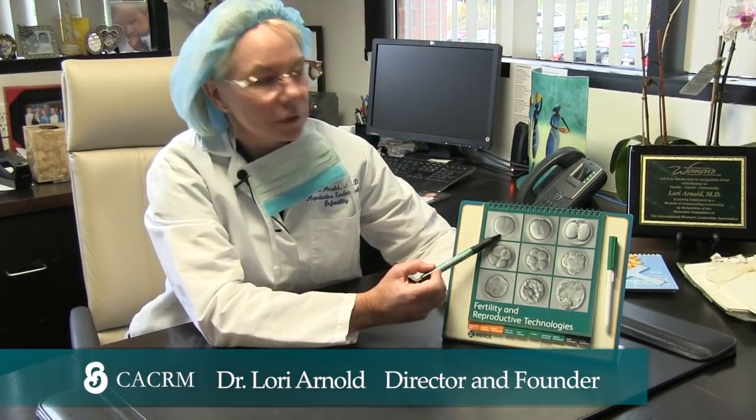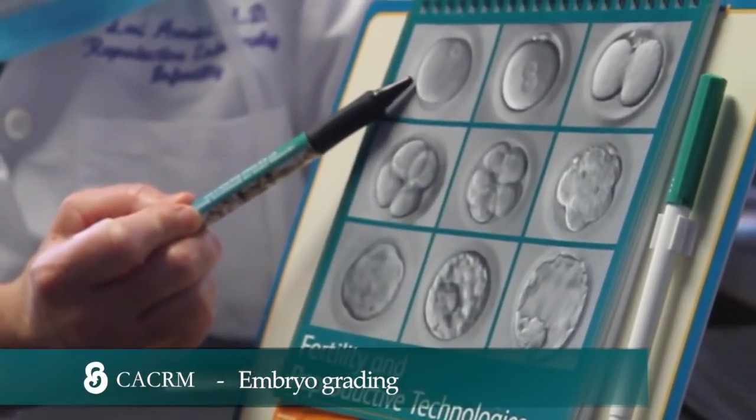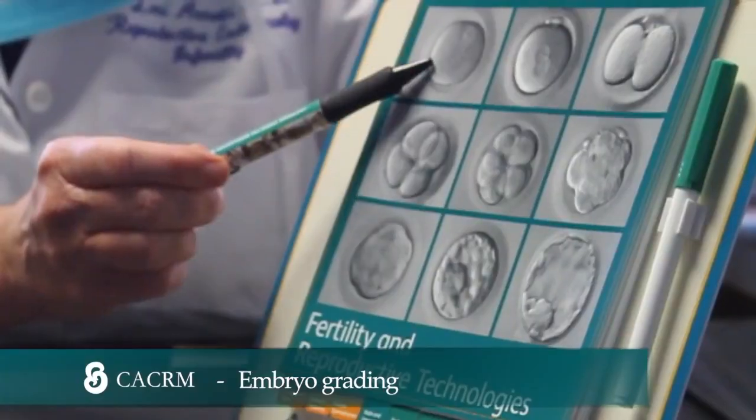When we do the egg retrieval, the eggs are looked at under the microscope for the maturity of the eggs. There are 4 different levels of maturity of an egg. A germinal vesicle egg, which is very immature, a metaphase 1 egg, and a metaphase 2 egg, which is the mature egg, or there's an atretic or post-mature egg.